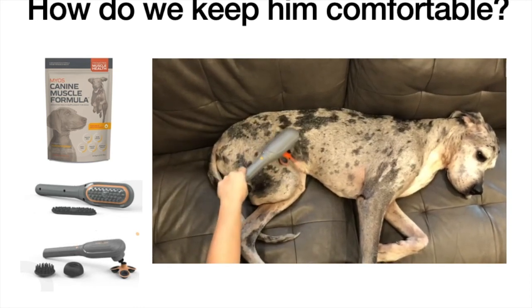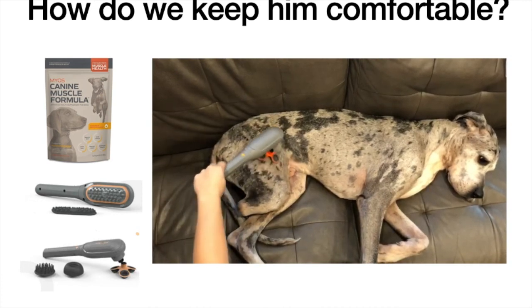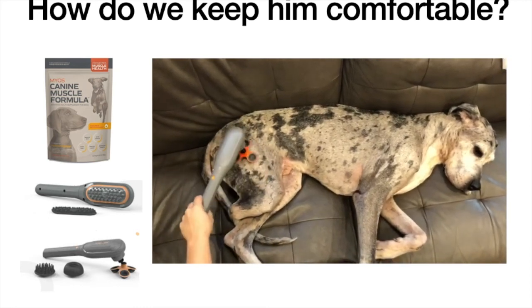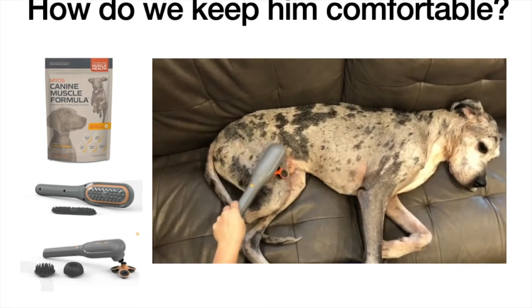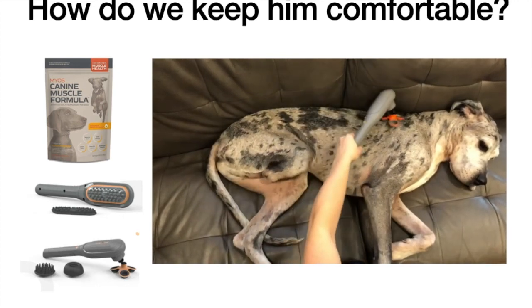Why? Because they will get trigger points. They'll get spasms. Again, we're trying to maintain the muscle mass and function. And so you can see we want to keep those muscles comfortable. We want to keep them relaxed. This is a great device, not only if your dog's had an amputation, but just if you have a dog in general. Think of us. We go to get massages. We use massage guns, massage therapy wands. They really appreciate it as well.